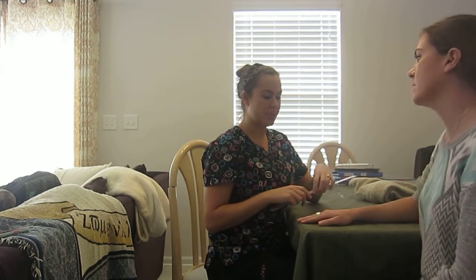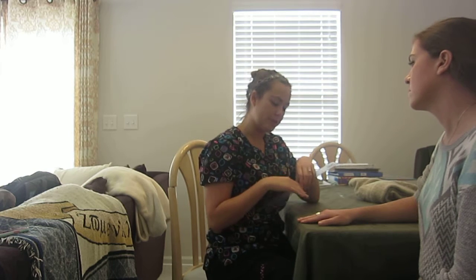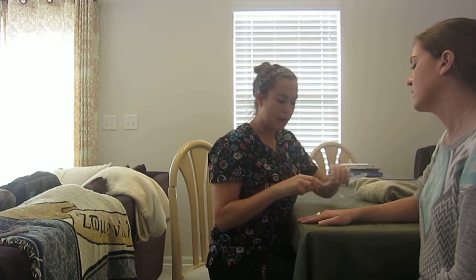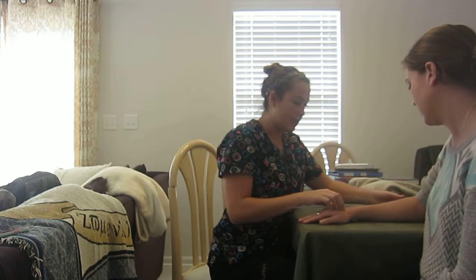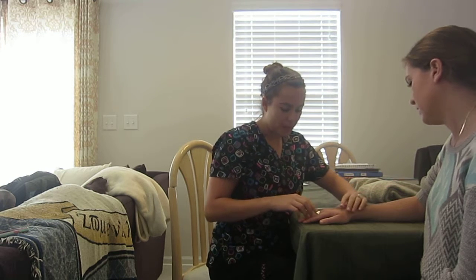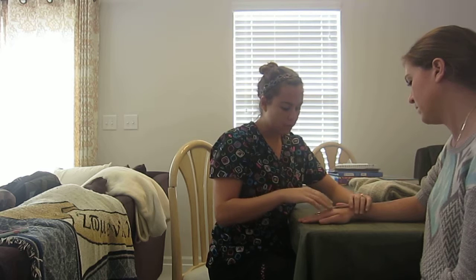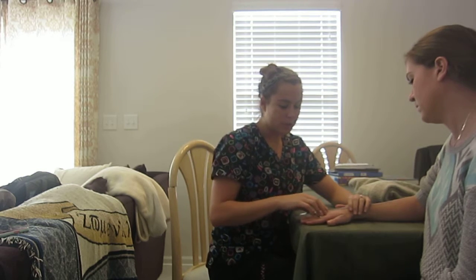So now what I'm going to do is called wrist radial deviation and ulnar deviation. So I'll start with radial, and I'm using once again the capitate for the fulcrum, the lateral condyle for the stable arm, and your middle finger. So what I want you to do is move your hand in this motion as far as you can towards your thumb.